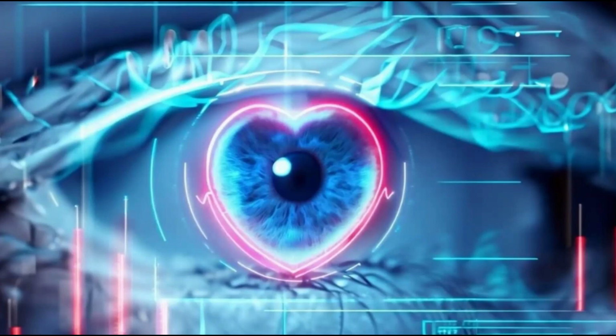I'm learning a little bit about the retina, how to look at the retina, and sometimes I just look at the fundus examination and try to predict also what is the risk score of my patients. I'm not an ophthalmologist yet, but we were very puzzled with these cases that were scoring high risk. And then, with the help of Sahil, we looked closely at the images of the retina, and we saw some signs, mainly AV nicking in some patients, some exudates. All of this we know from previous research, before oculomics, was linked to subclinical cardiovascular disease and vascular deterioration.